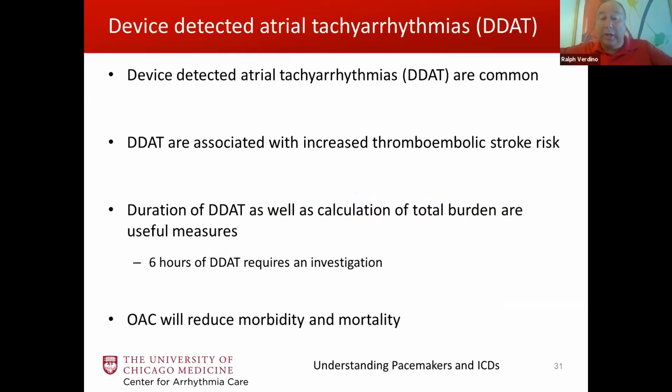Another question from the audience. Can the pacemaker differentiate flutter, fibrillation, and SVT? Excellent question. So it depends on the rate. For example, you are able to program the atrial rate that you want recorded and alerted to you. And so sometimes very fast SVTs can fall into that category, and you may get an alert. Well, how do you differentiate the two? By looking at the electrogram.